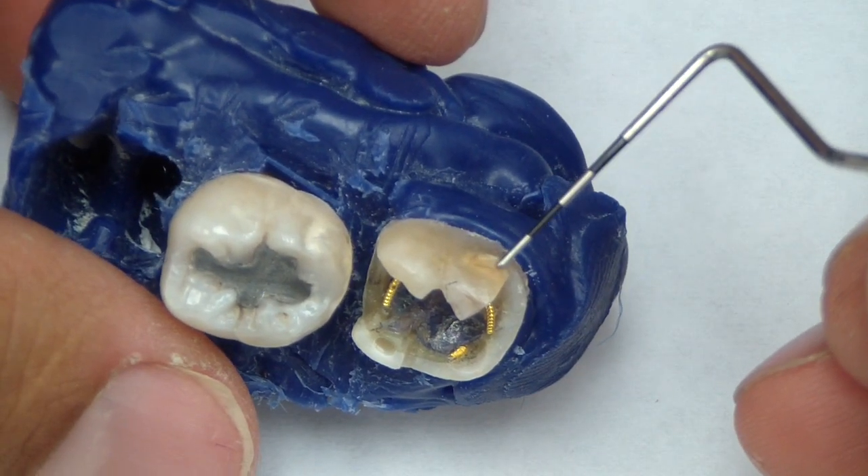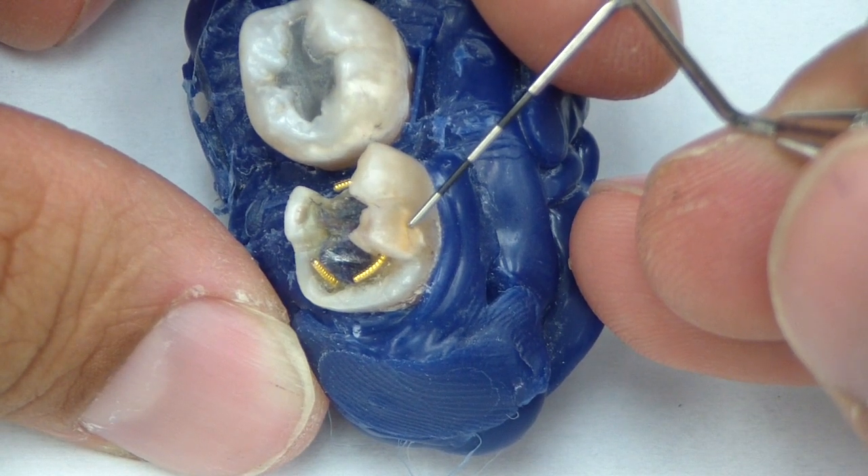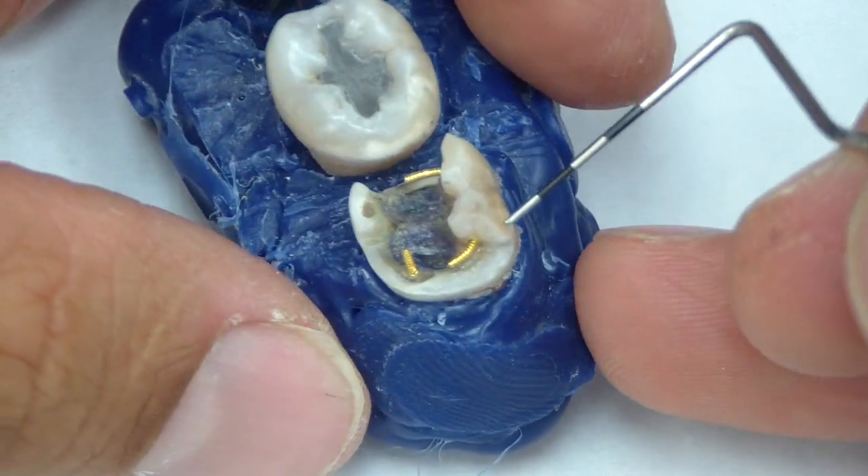You can see some incipient caries here — it's non-cavitated. The literature is fairly solid on not having to prepare that, just placing fluoride varnish to remineralize it.